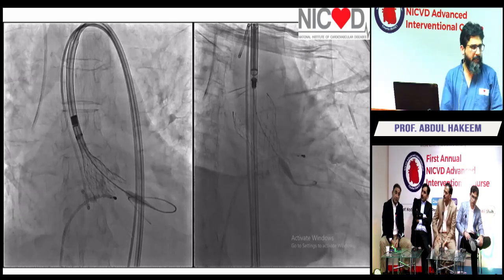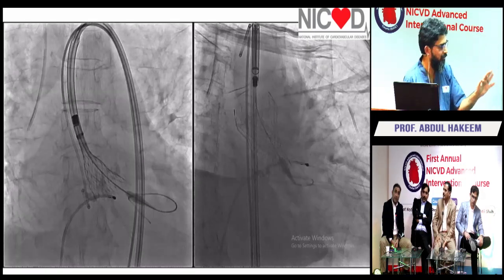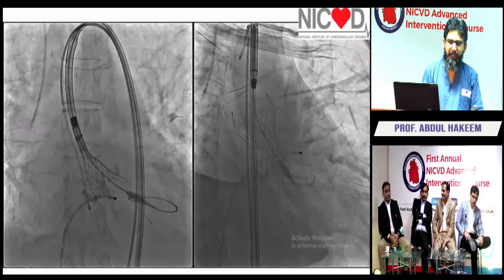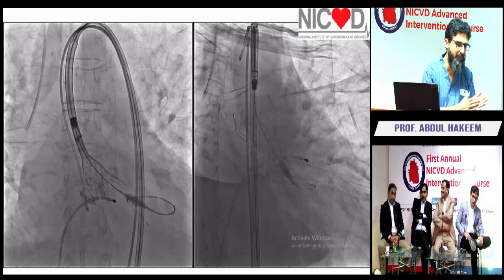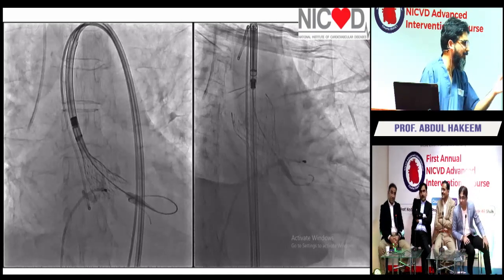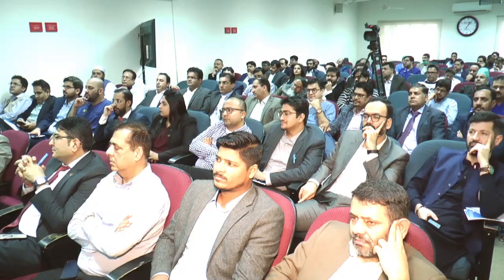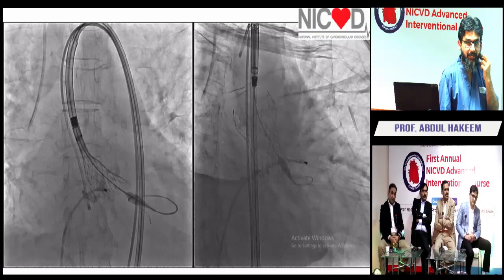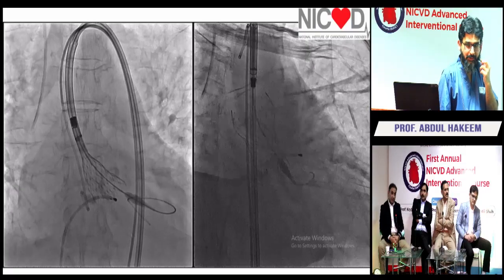So I think some of you know this case, so you don't comment, okay? So what should we do at this point? This looks great. We high-five each other and call it a day. It's a Saturday. And by the way, we have another case to do in the afternoon as well. So what should we do at this point? You guys like how the valve is deployed? Yes? Everybody agrees? So we're done.